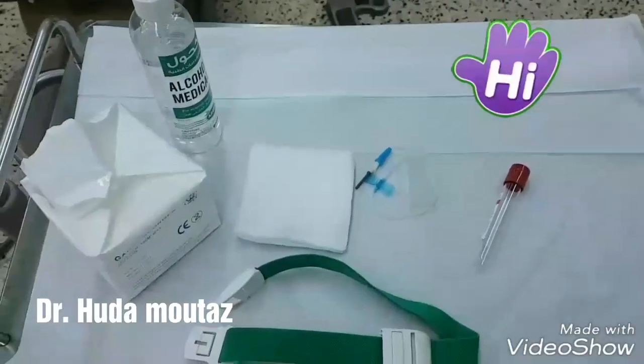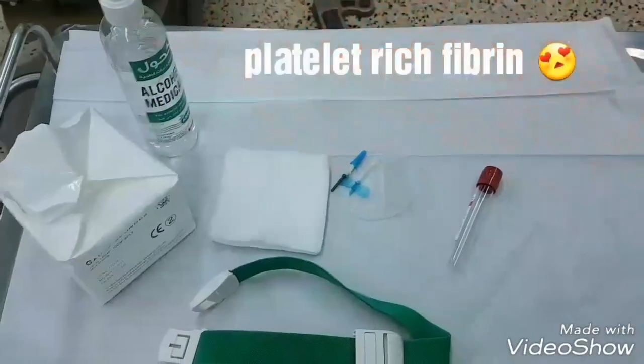Hi, everyone. I will explain the platelet-rich fibrin preparation to you.